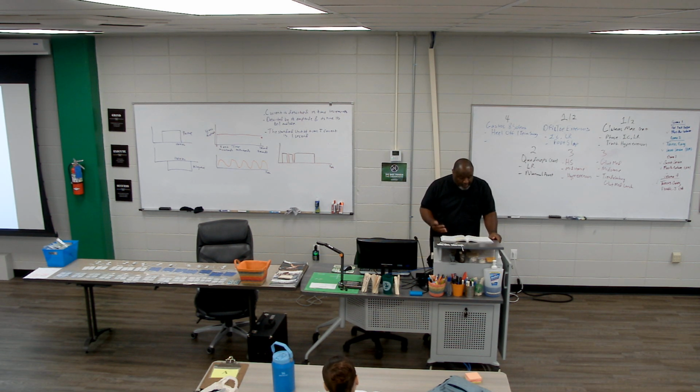It says in comparisons among symmetrical biphasic, asymmetrical, balanced biphasic, monophasic, and polyphasic, biphasic was most often preferred. Between the two biphasics, symmetrical was preferred with stimulation of large muscles, whereas there was no preference between small muscle stimulation.